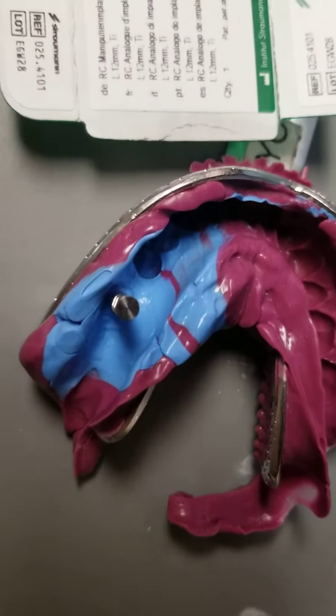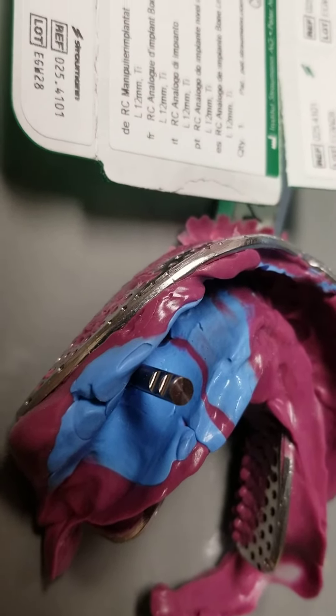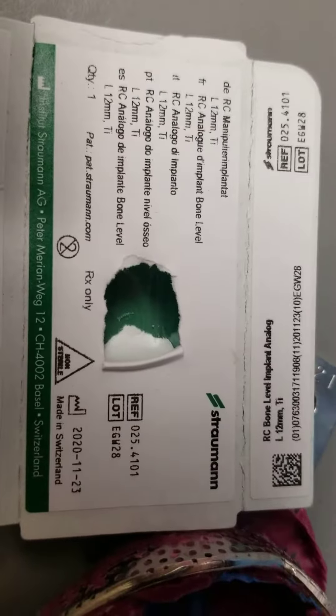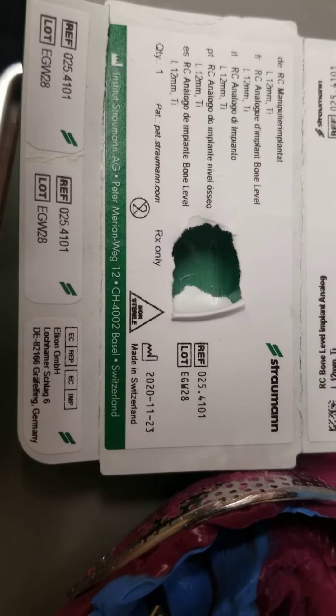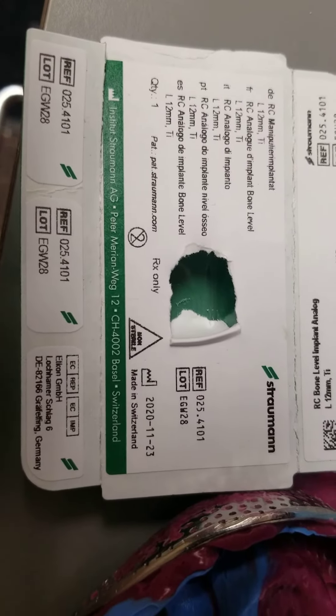Here is the lab analog in place, the one we just received in the mail that I did a video on prior. This is the actual implant. It has everything on it from the lot number to the reference numbers, the type of implant, and that's pretty much it.